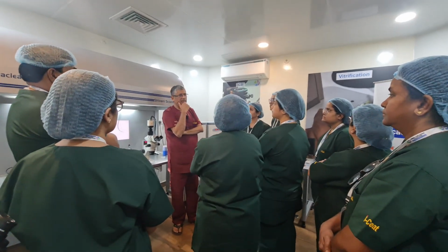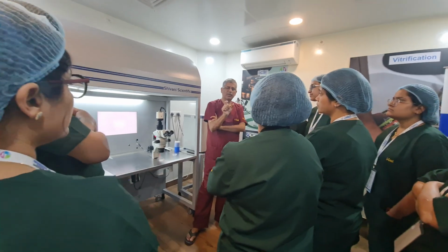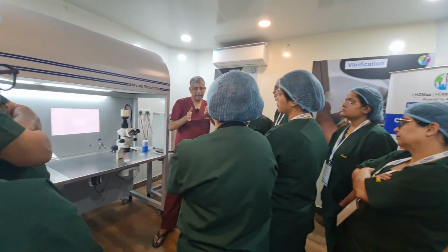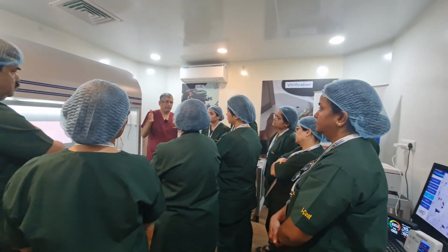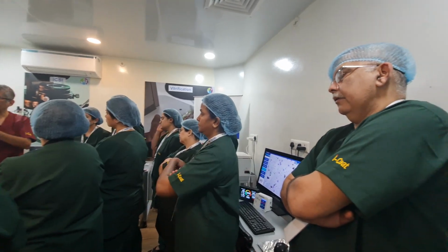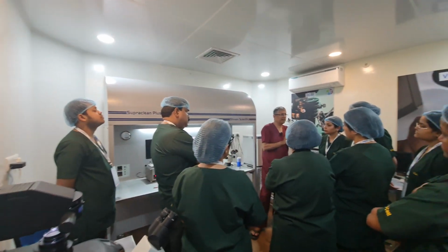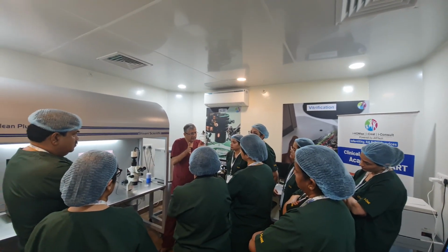The third option which you have is the modular. In a modular, we have small brackets which are 5 centimeter broad, and they have one outer layer and an inner layer in which we fill the foam. The foam has a density of around 40 to 50 kilogram per meter cube. So the more dense foam you fill, the denser they will become.